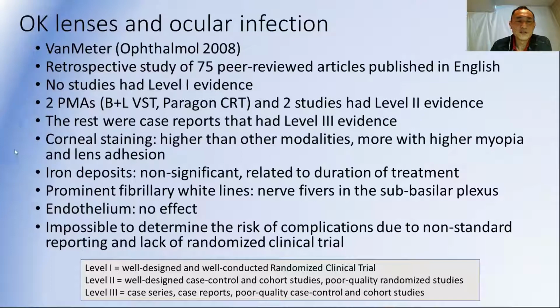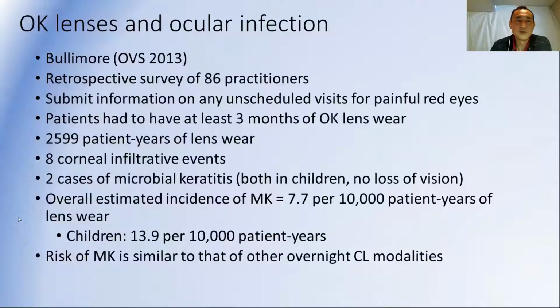A couple of other studies found that there may be an increase in infection rate compared to regular contact lens wear, but it's really impossible to determine the risk of complications because of non-standard reporting and the lack of randomized clinical trials. But that's something that's probably going to be looked at more so down the road.